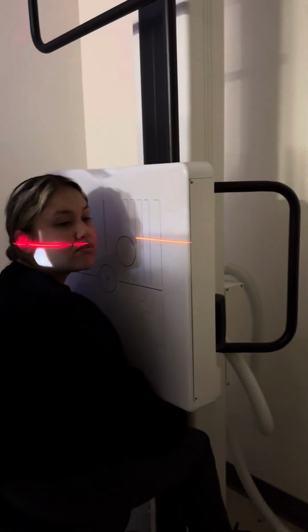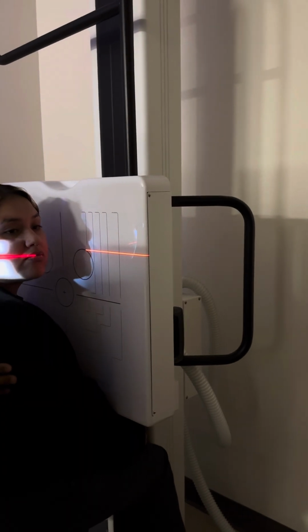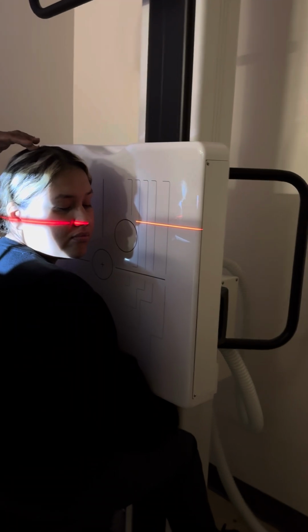So you don't center at the IOML and the EAM anymore for this one? You do. This is still an IOML because it's a lateral. Laterals will always be IOML. SMVs will always be IOML. Everything else will be OML.